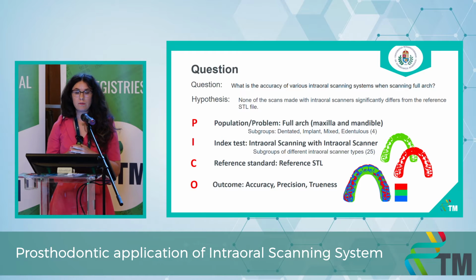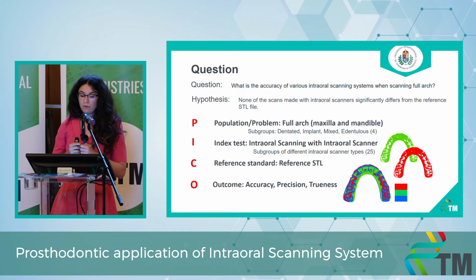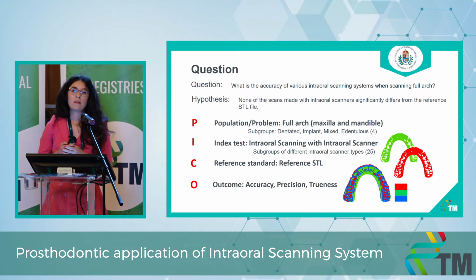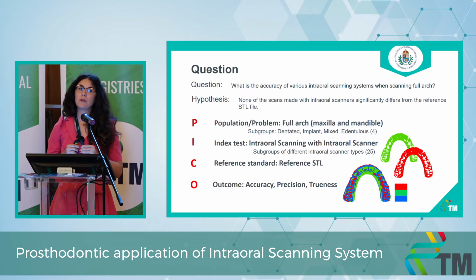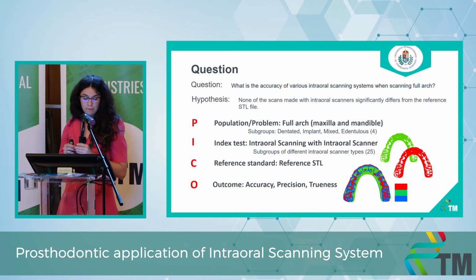Our hypothesis is that none of the scans made with the intraoral scanners differ significantly from the reference STL file. In our population, we have full arch maxilla and mandible, and we made 4 subgroups for the outcomes. Our indexes are the different intraoral scanners available in the market, and we investigated 25 of them.